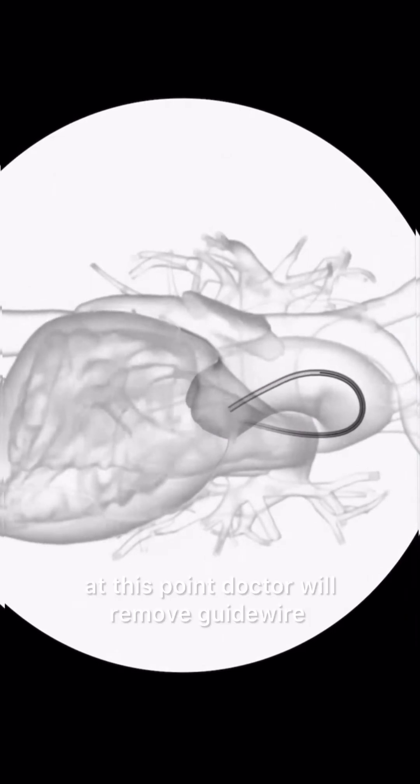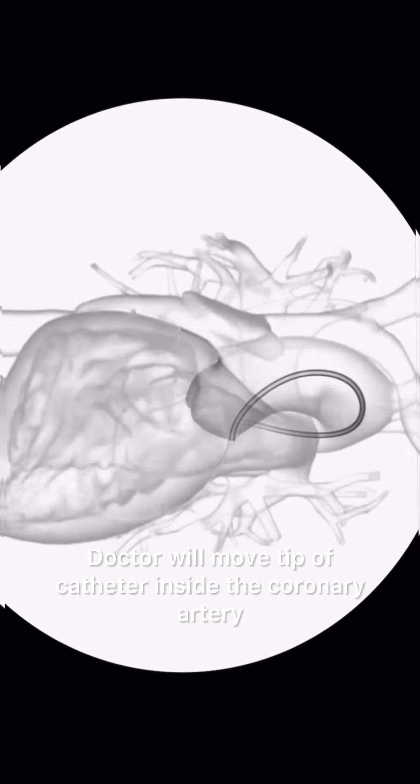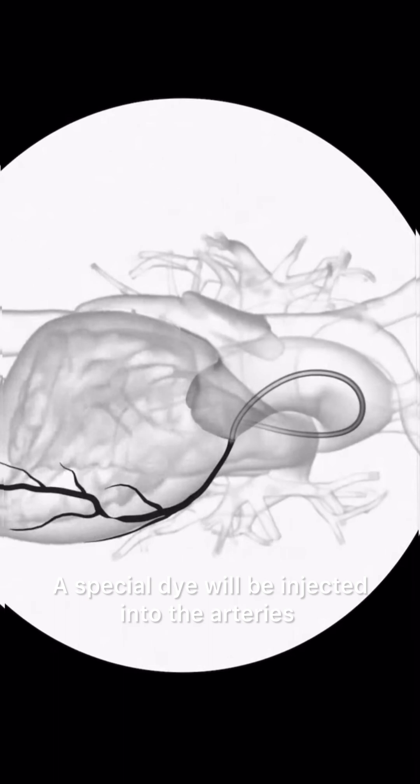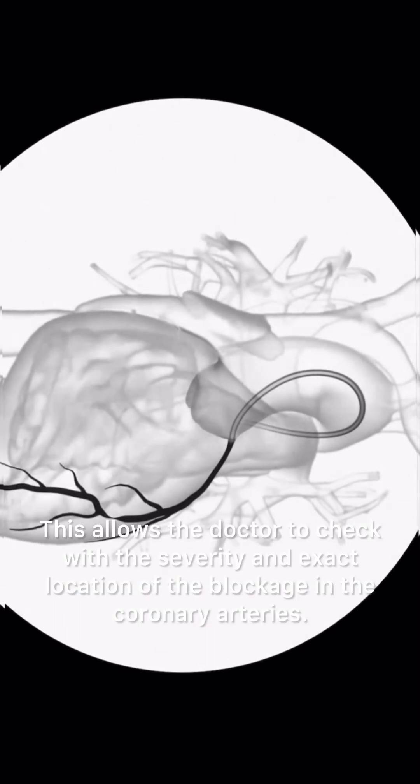At this point, the doctor will remove the guide wire and move the tip of the catheter inside the coronary artery. A special dye will be injected into the arteries. This allows the doctor to check the severity and exact location of the blockage in the coronary arteries.